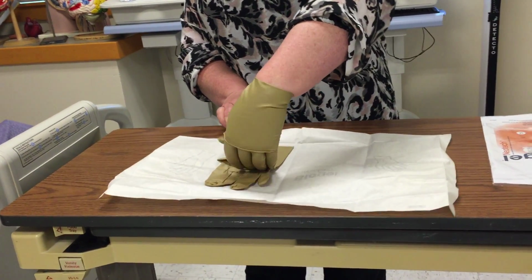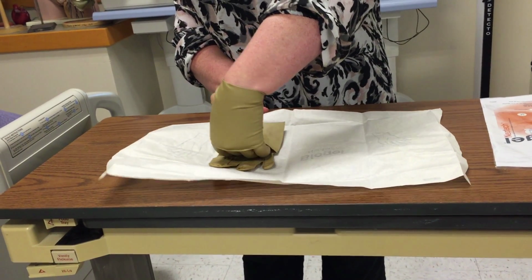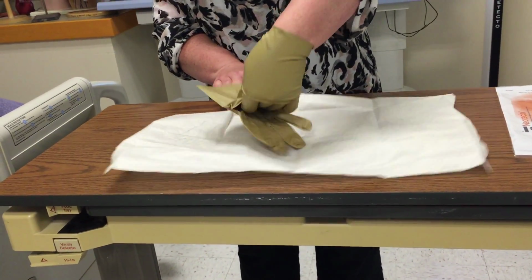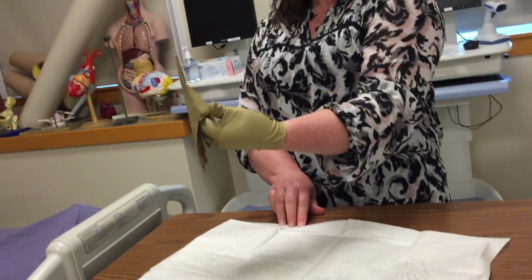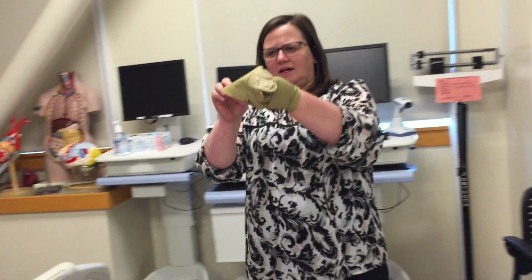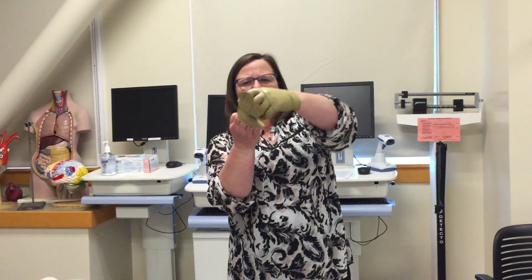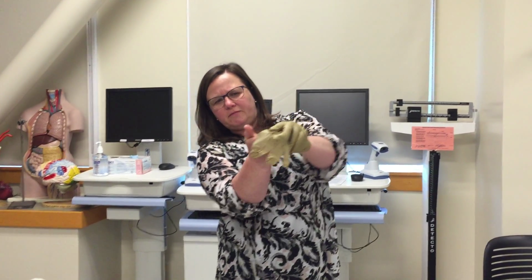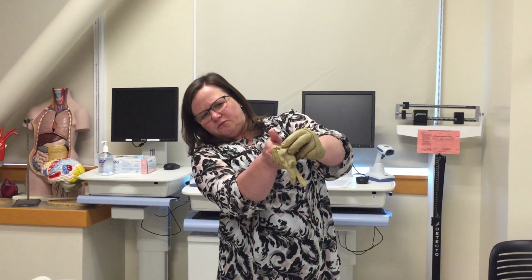Now my second glove, this is a sterile glove, so now I'm going to take hold of the glove from inside the cuff. See how I'm holding it there? Okay, so I'm inside the cuff, step back. Once again, I'm going to hold my hands up and away. Did the fingers touch? Pull down. Okay. You're paying attention to those wiggly fingers.